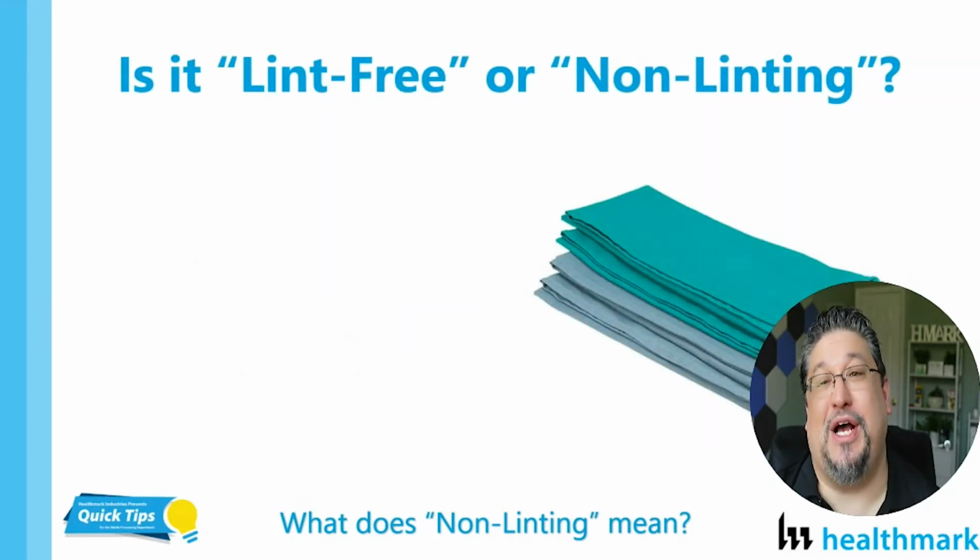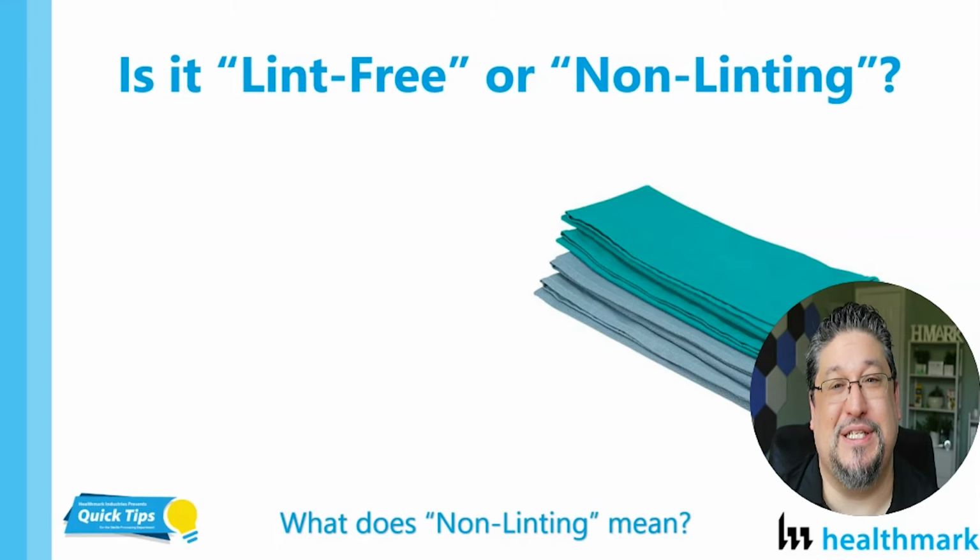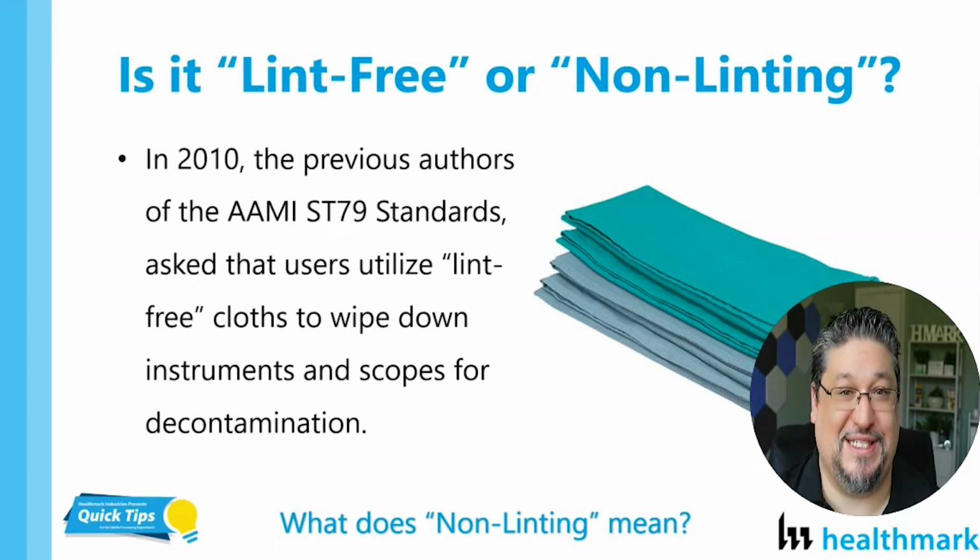So when we see that terminology or surveyors come into our departments, why do they say, well, you need to use a lint-free towel? And again, that's kind of a misnomer. It's not such a thing as a lint-free towel. So that terminology actually came from 2010. The AAMI standards actually stated utilizing lint-free cloths to wipe down instruments and scopes for decontamination.